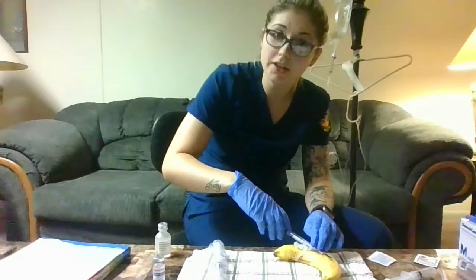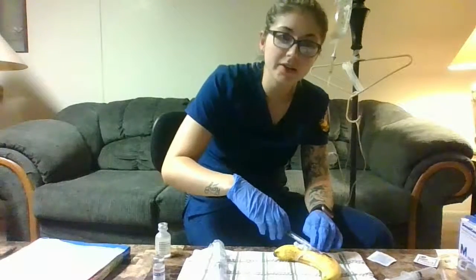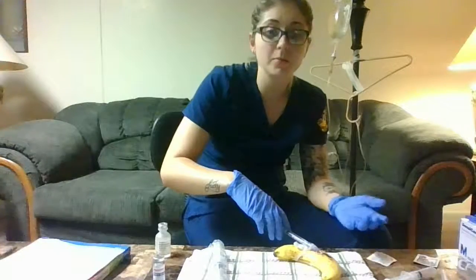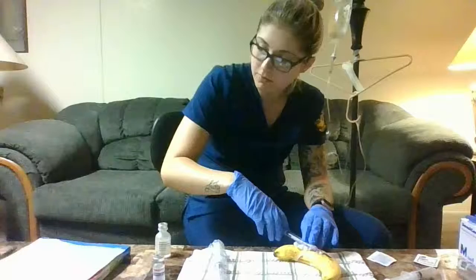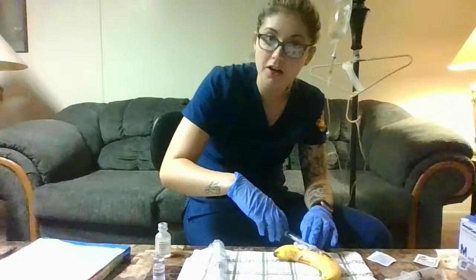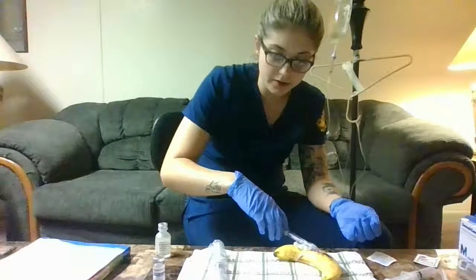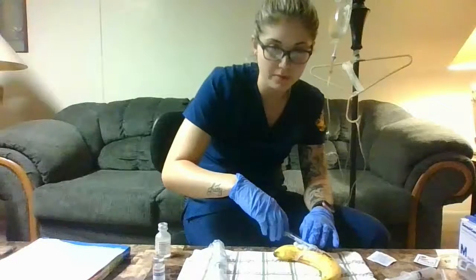And so while we're slowly infusing it over that time, we're going to monitor for adverse reactions. Make sure the IV is still in there okay. There's no problems with the IV. So after that's the amount of time, 1.5 milliliters per 1 minute. And we get all the 3 milliliters in. So 2 minutes altogether after that's all in.